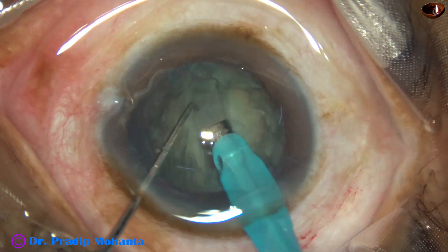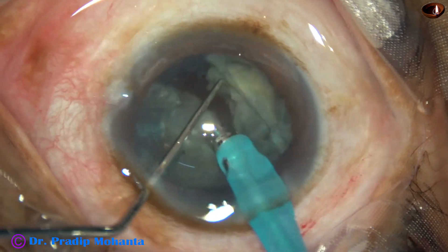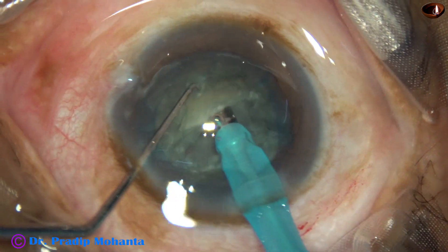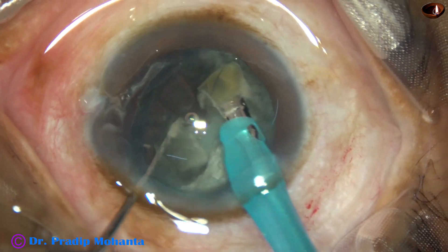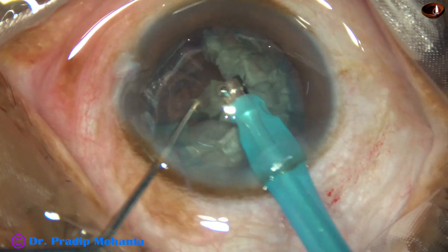The nucleus is rotated 180 degrees, sculpted on the other side, and divided into two halves. Then I go to FACO 2 mode where the vacuum is higher, about 400, and flow rate is 40. The hemi-nuclei are chopped into pieces and the pieces are emulsified.